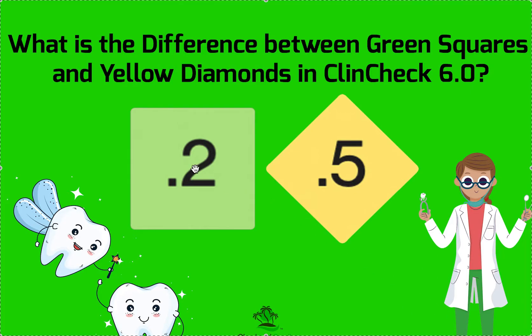The green squares represent existing space. For some reason, they don't always flag it like they're supposed to — sometimes they do, sometimes they don't. So it's really helpful with super small spaces just to know that they're there, and it's really helpful when you're on a refinement to know that space is there and whether you're closing it or not.